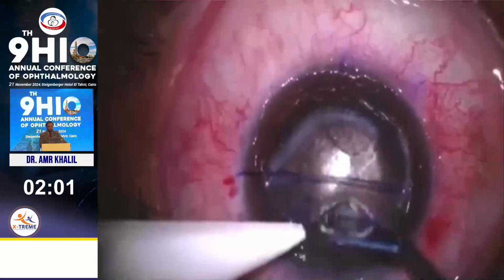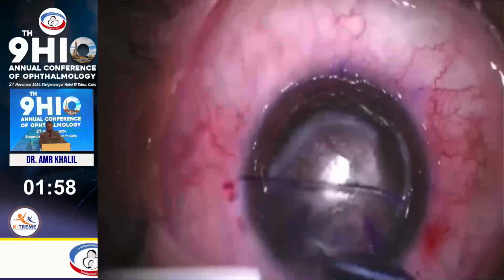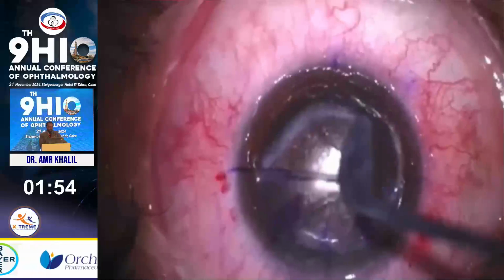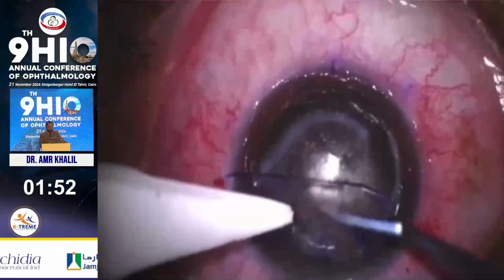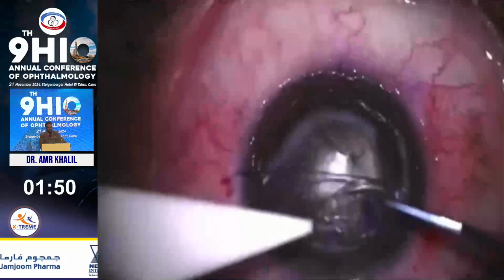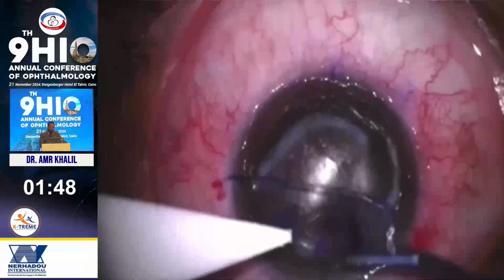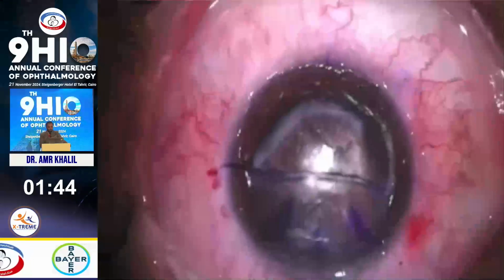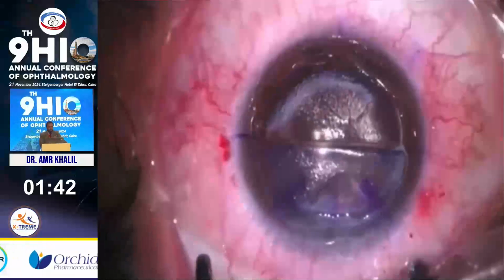Then I will try to scrape the posterior surface of the flap. I'm supporting the flap with a sponge, then with the Hockey knife, gently scraping the posterior surface, especially the edges of the flap.